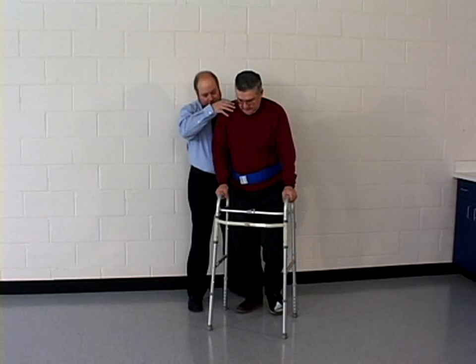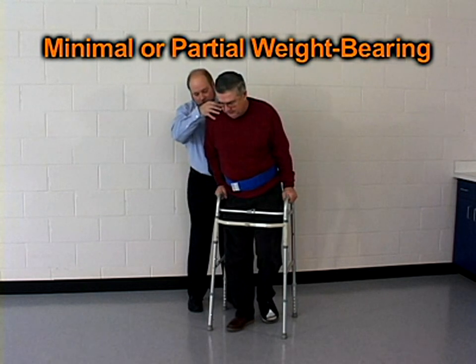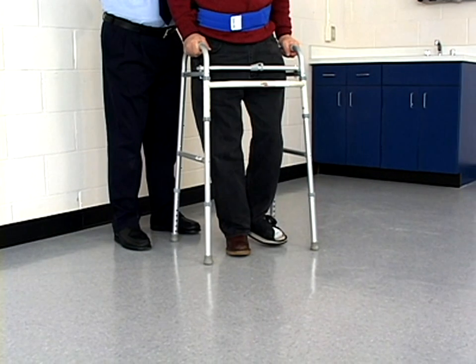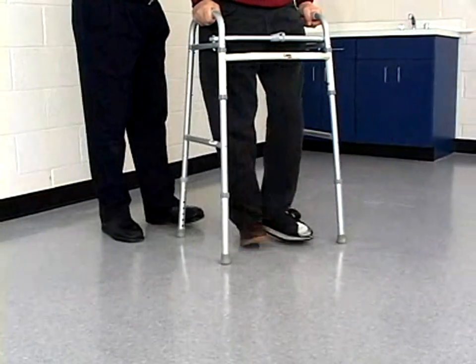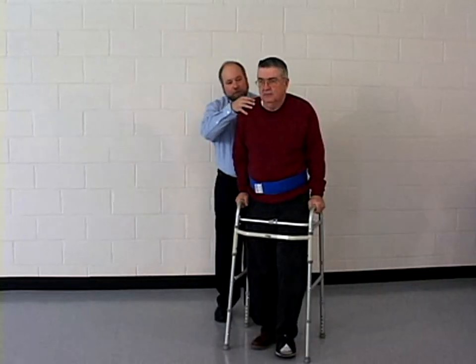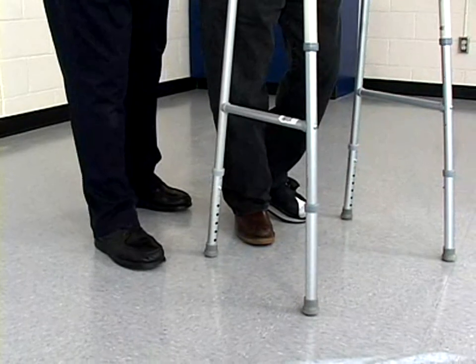For patients who use the 3-point gait pattern, the therapist must be positioned in stride, behind and to one side of the patient. The therapist then grasps the gait belt and the patient's shoulder. Again, the patient begins by standing centered in the walker. The involved lower extremity is not rested on the floor. It may be held with the knee in extension, putting the foot in front of the patient, or it may be held with knee flexion, putting the foot behind the patient.